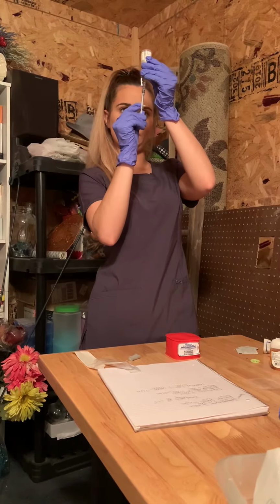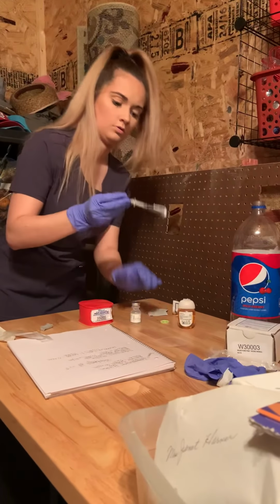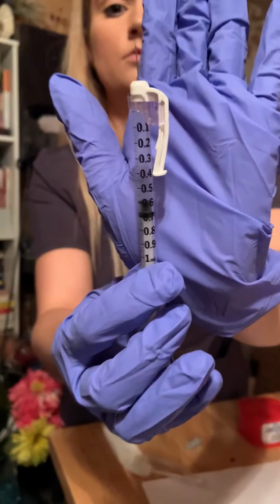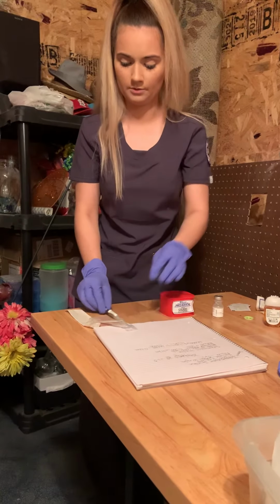You want to keep this eye level as well and at a 90-degree angle. There's no air bubbles in this. If there were, you need to tap them out. And then you will use the scooping motion to recap it.